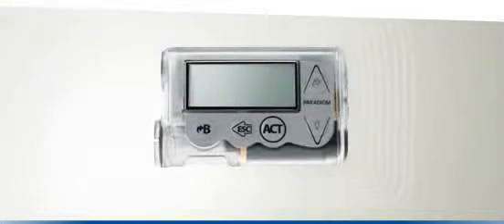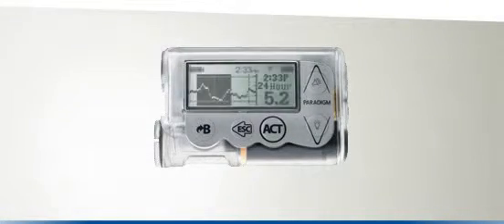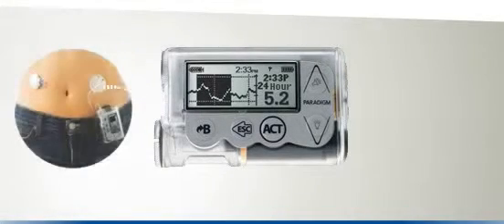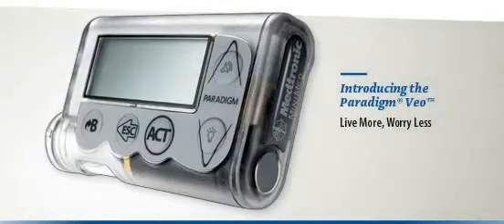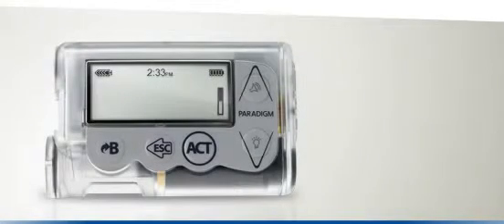Now let's take a closer look at the Paradigm Veo itself. The Paradigm Veo is simple and easy to use for new and experienced users. There are five buttons that will help to navigate screens, make selections, and enjoy the full functionality of the pump.